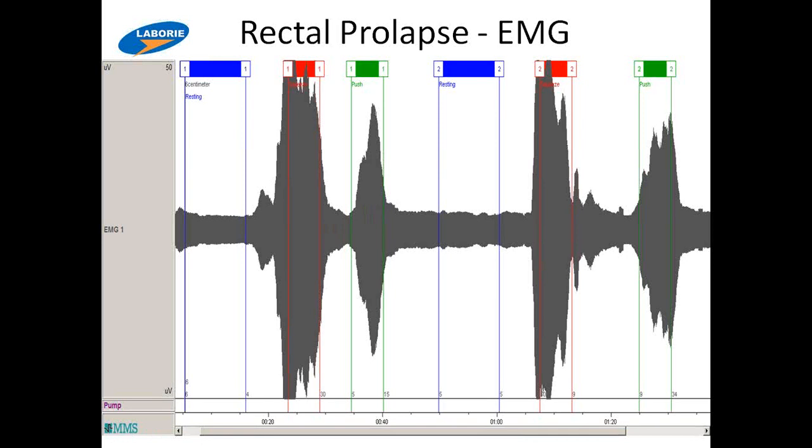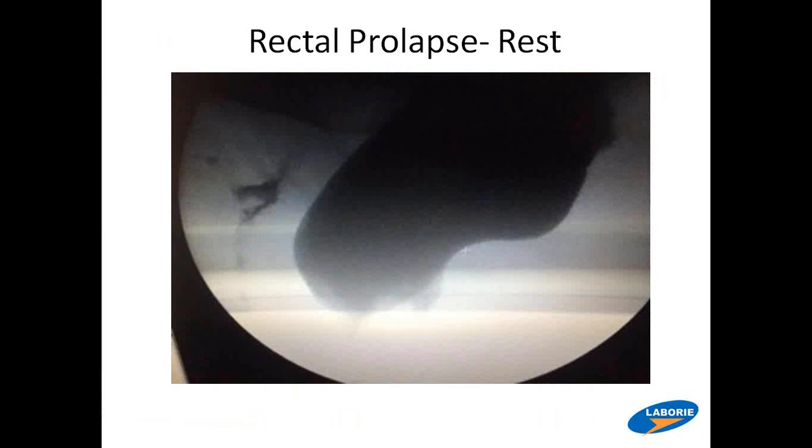It's simulating a squeeze, if you would. I do have her defecography. You've probably already seen it, but let me just show you because it's very impressive. The one thing I would say about this up front, here's the rectovaginal septum, it's a little thicker, which makes sense, and then you have the contrast in the vagina. Now the anus is down here. Actually, it's over here. So you can get ready for that.